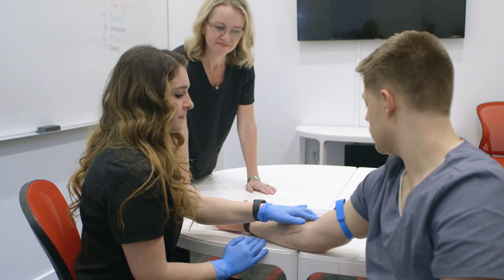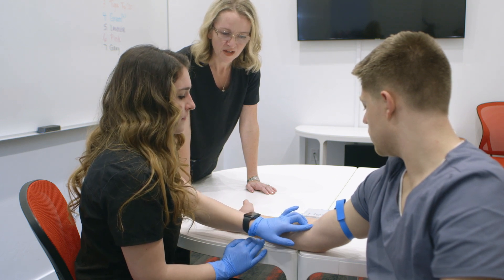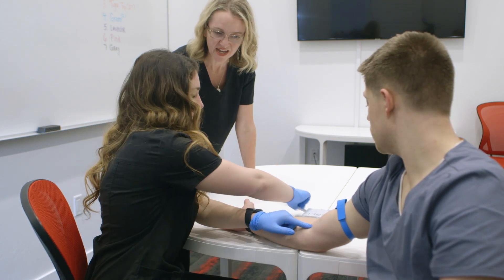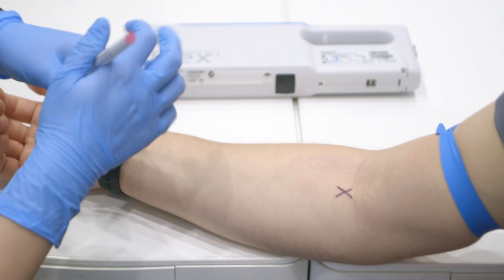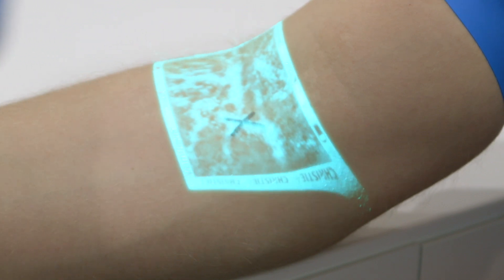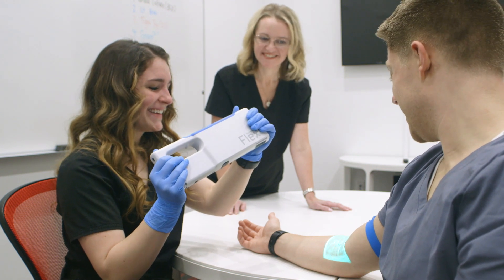One of the most time-consuming parts of learning phlebotomy is locating veins by feel. During instruction, we use the Vein Viewer to help students become comfortable and accurate locating veins by feel. We first have them feel for the vein, then have them mark what they think is a vein, then we turn on the Vein Viewer to see if they are correct. This dramatically speeds up learning how to identify and locate veins by feel, thereby making the student more effective and efficient.